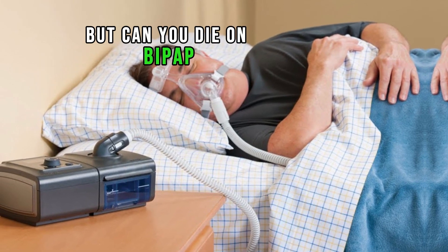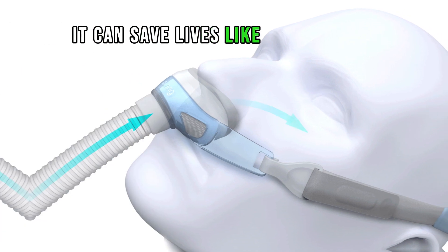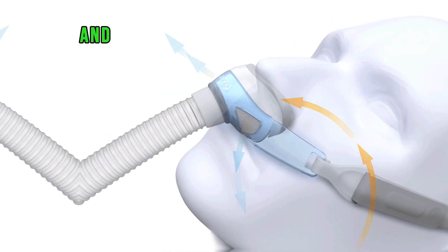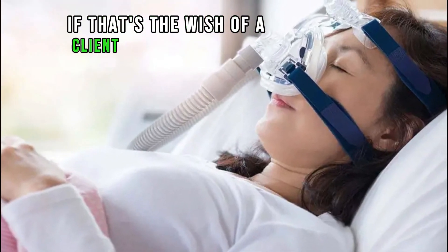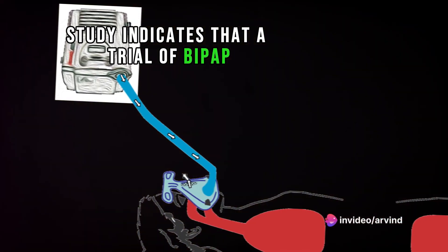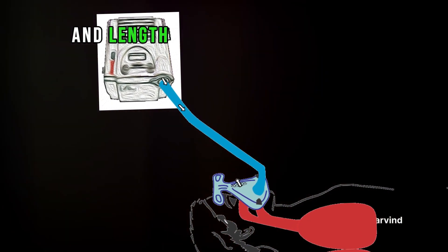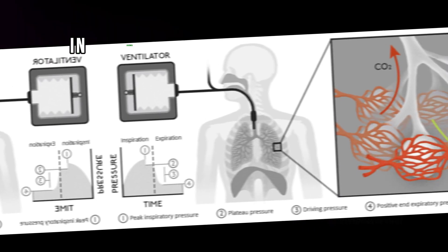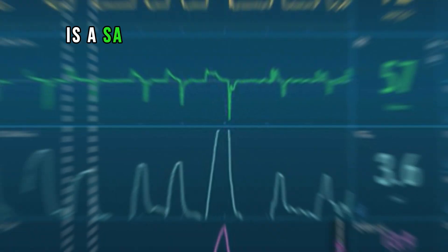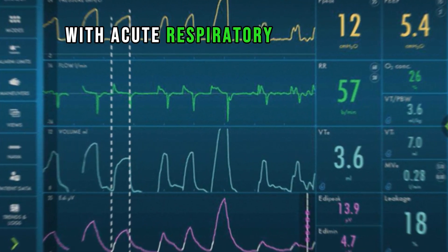But can you die on BiPAP? The answer is yes. But in other situations it can save lives — for example, with intensive care at home. We can prolong life at home if that's the wish of a client and family. Studies indicate that a trial of BiPAP is effective in improving gas exchange, reducing intubation and length of stay in hospital in patients with acute respiratory failure, suggesting that NIV is a safe and effective means of ventilator support.